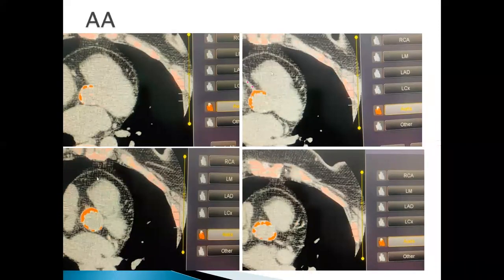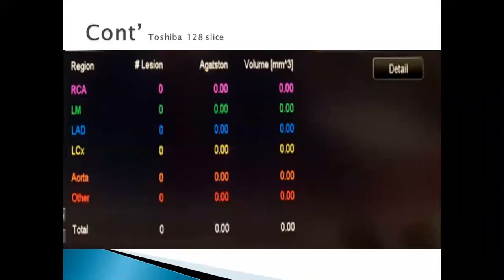Now, the aorta is also one of the arteries that you're going to assess for calcification, but only the ascending aorta. Do not include the descending aorta, only the ascending aorta. So it gives you the color orange, and you start following it now from the way it's started. You click wherever you see a calcification, you click, and here there's this table.